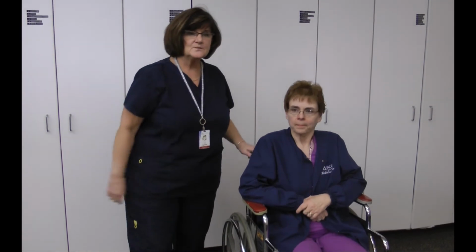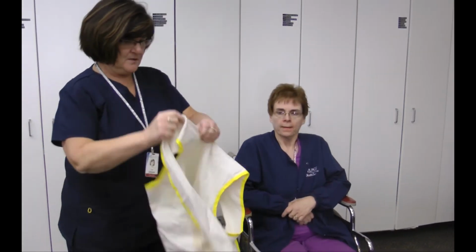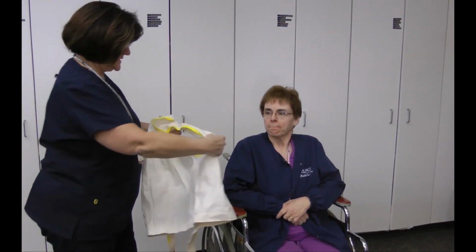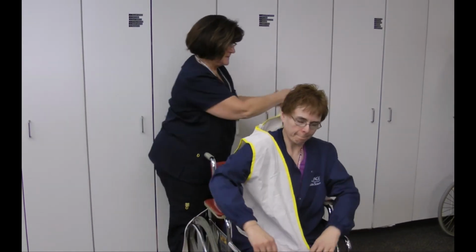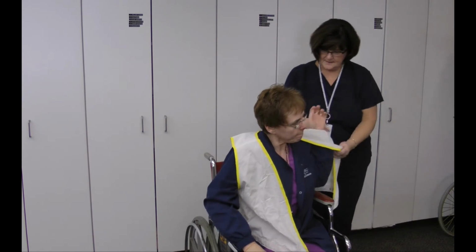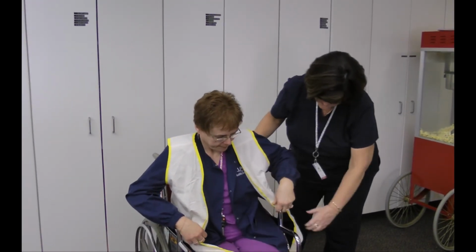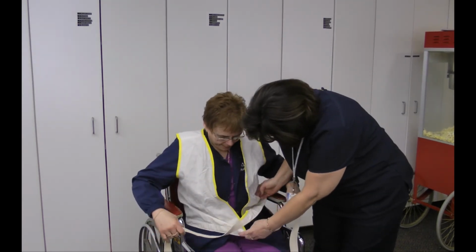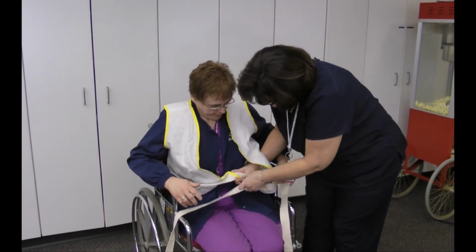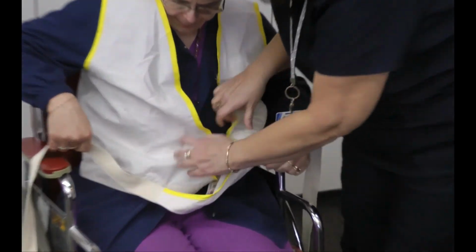Okay? The last one I want to show you is the vest restraint. A little bit more technical, but it's going to go on and cross again. So Melissa, we're going to ask you to put your arm through there. Okay? Put it around. It's got big long strings on it. Good job. Go down in the back. The long strings, they go through this one. And right over the top of this one.